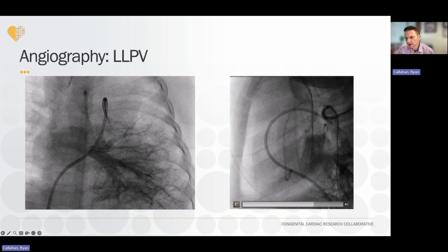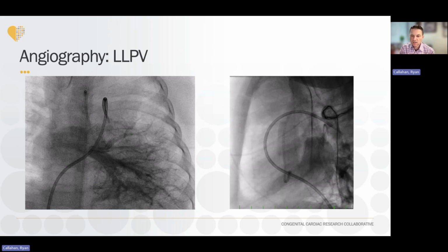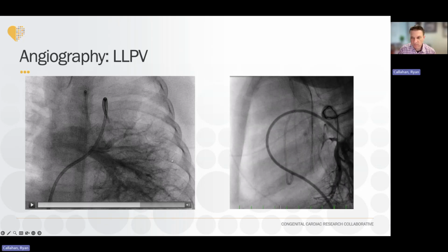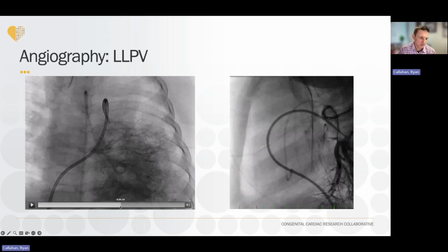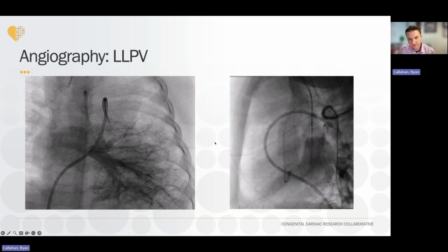And the lateral shows the anterior posterior distortion, but this example is just the other side, where you can have anterior posterior compression of a normal vein, but the key is it remaining tall superiorly and inferiorly as it enters the heart. In this situation, it is not. So there is PVS in this vein.